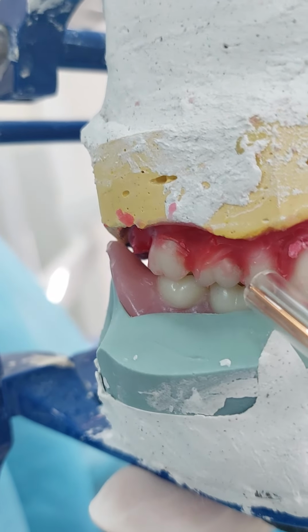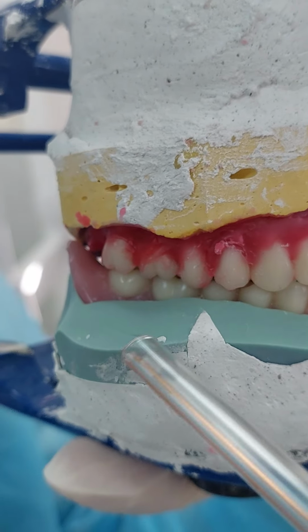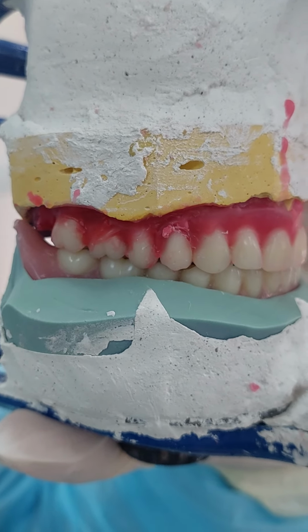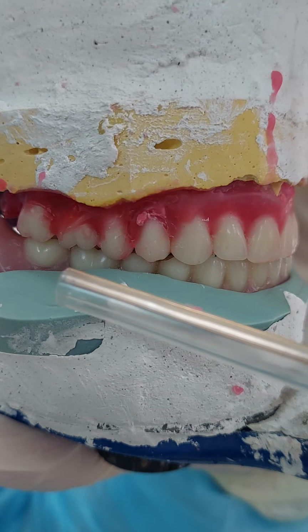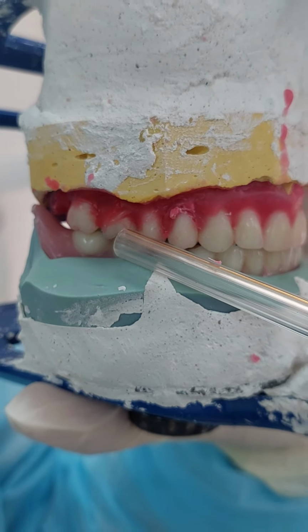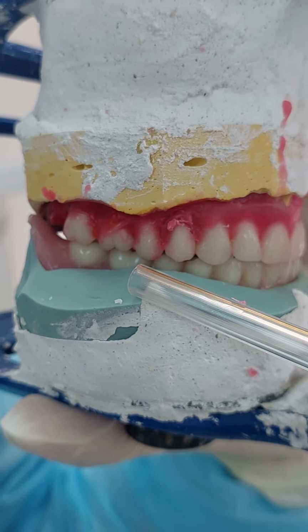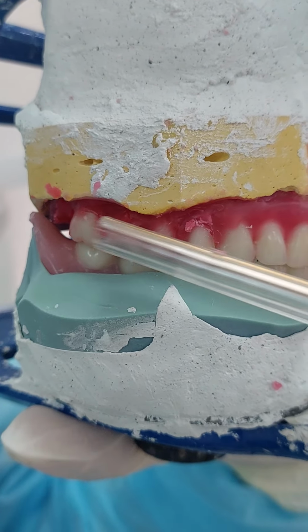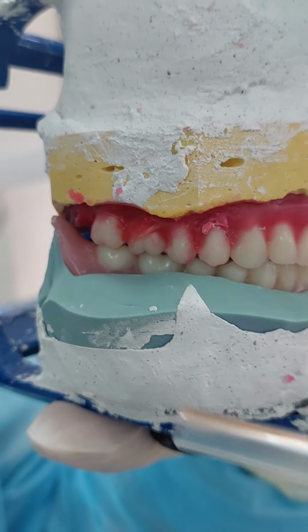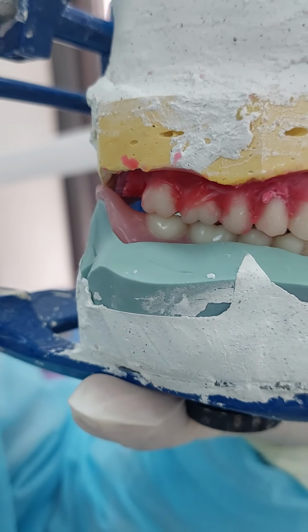What happens if I leave this? It once happened when I missed a tooth like this in a denture and delivered the denture. The patient came back saying that he was biting his cheek, especially in the buccal pad. You remember that a lot of fat is there, so the cheek will go in between. This will not prevent it. The reason we have a buccal overjet, meaning the palatal cusps of the buccal teeth are inwards and the upper buccal cusps are outwards, functional and non-functional, is to protect the tissue from biting. So if I deliver this, the patient will come back biting his cheek.